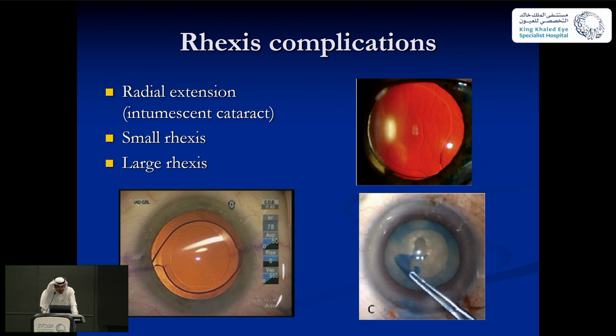So here in the bottom right, you can see the tumescent cataract, and that was decompressed before doing the rhexis.